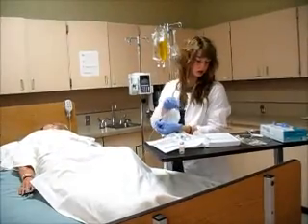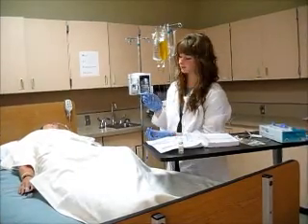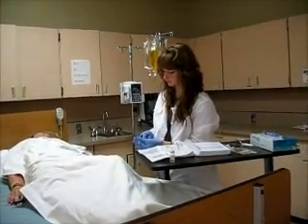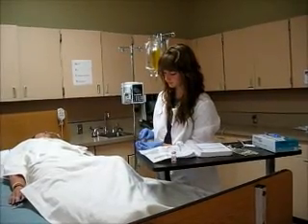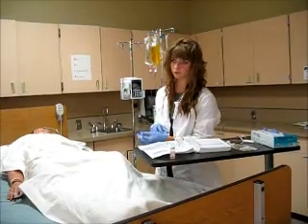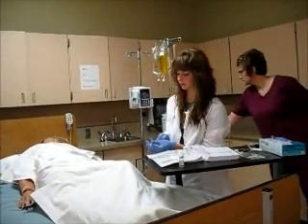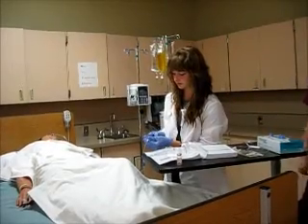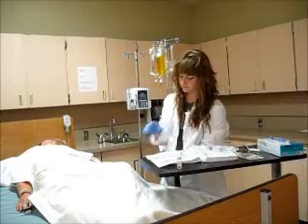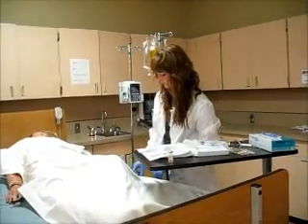Since I dropped that, I would also alcohol swab it off again. And then I have my flush, and I'm going to put that on. I'm going to watch the clock again and give this over 1 minute, so I make sure that the insulin goes all the way through the tubing over 1 minute. Alright. So that was my bolus, and I'm watching my infusion site as it goes in, making sure that there's no infiltration.